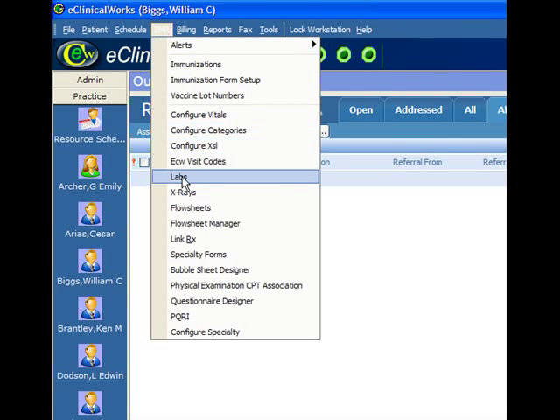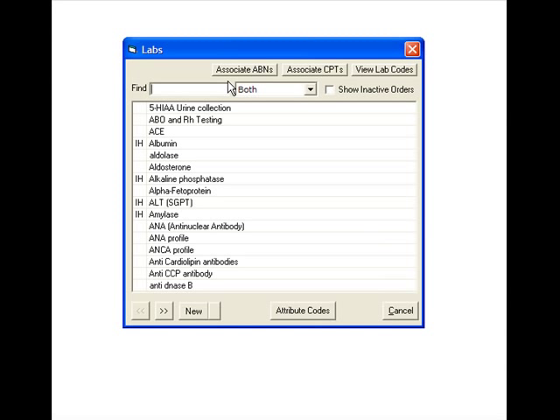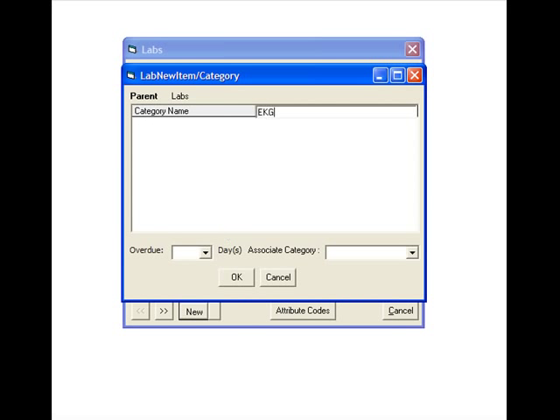First let's create the item. We'll go to labs, we'll make a new lab item by clicking new, type in the word EKG. This one says EKG2, we'll click OK.